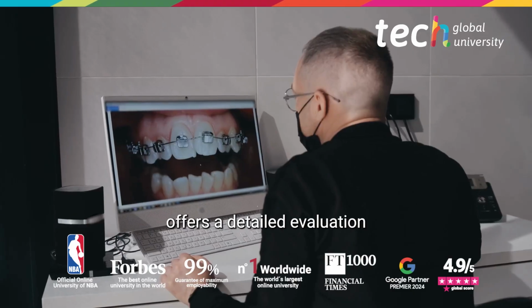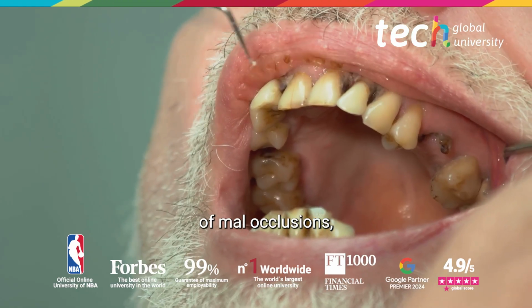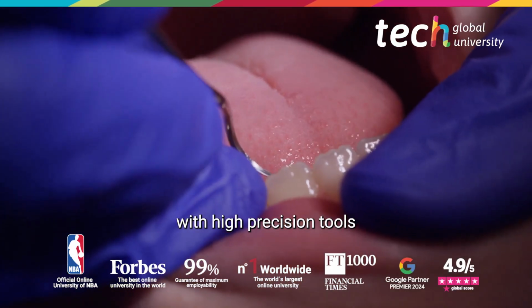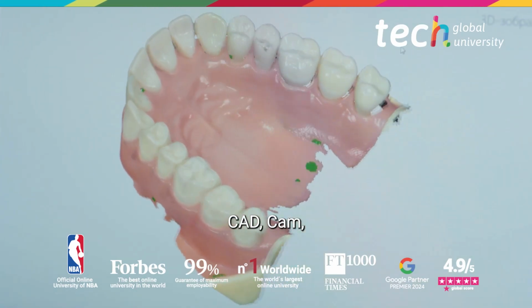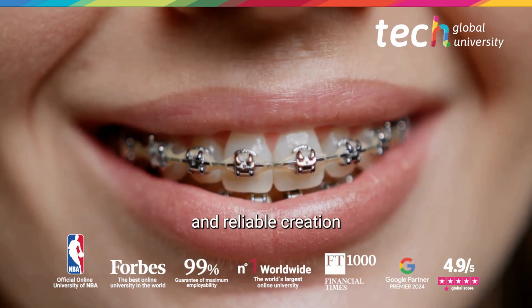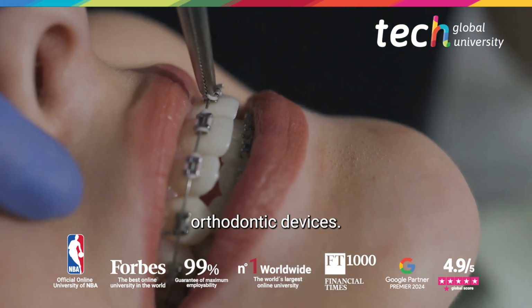Digitalization offers a detailed evaluation of the dental arches, promotes early detection of malocclusions, and allows dental movements to be planned with high precision. Tools such as computer-aided design and manufacturing, CAD/CAM, and additive manufacturing enable the agile and reliable creation of aligners, splints, and customized orthodontic devices.